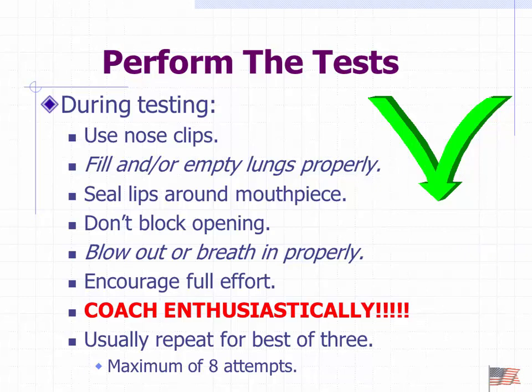Nose clips, you don't necessarily have to use them, but in many cases patients have a tendency to exhale through their nose, so you're not getting the full volume. We want to make sure that they fill and empty their lungs appropriately. So for tests like the forced vital capacity, take a deep breath in, deep, deep, to maximal inhalation, and forcefully exhale until you can't blow out any more.